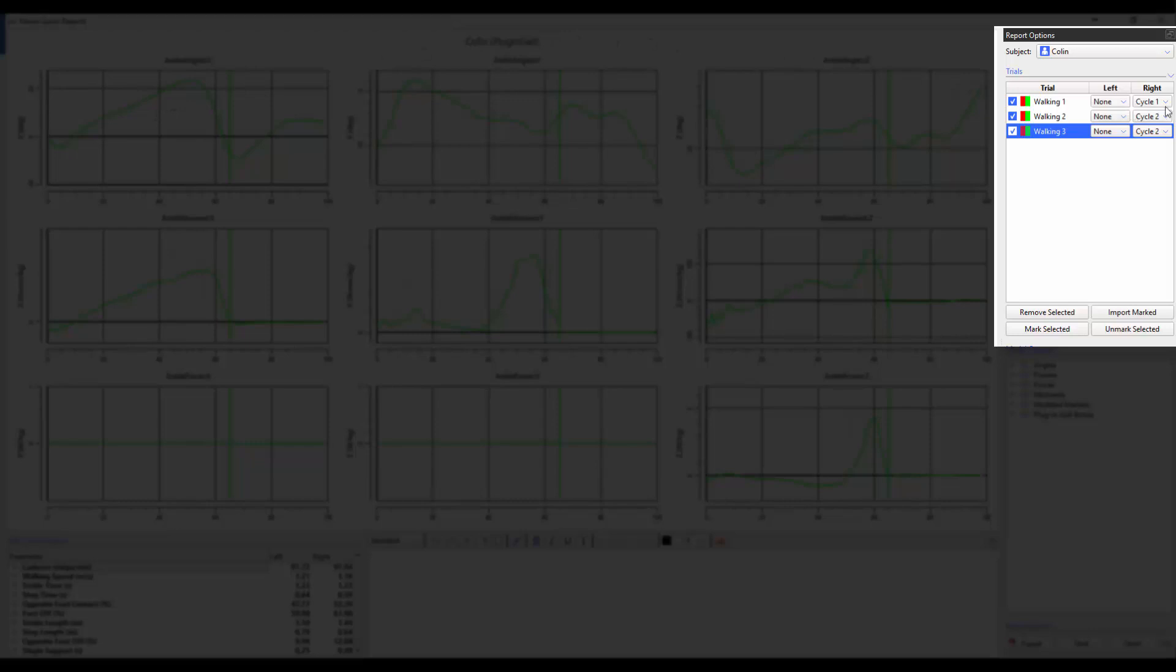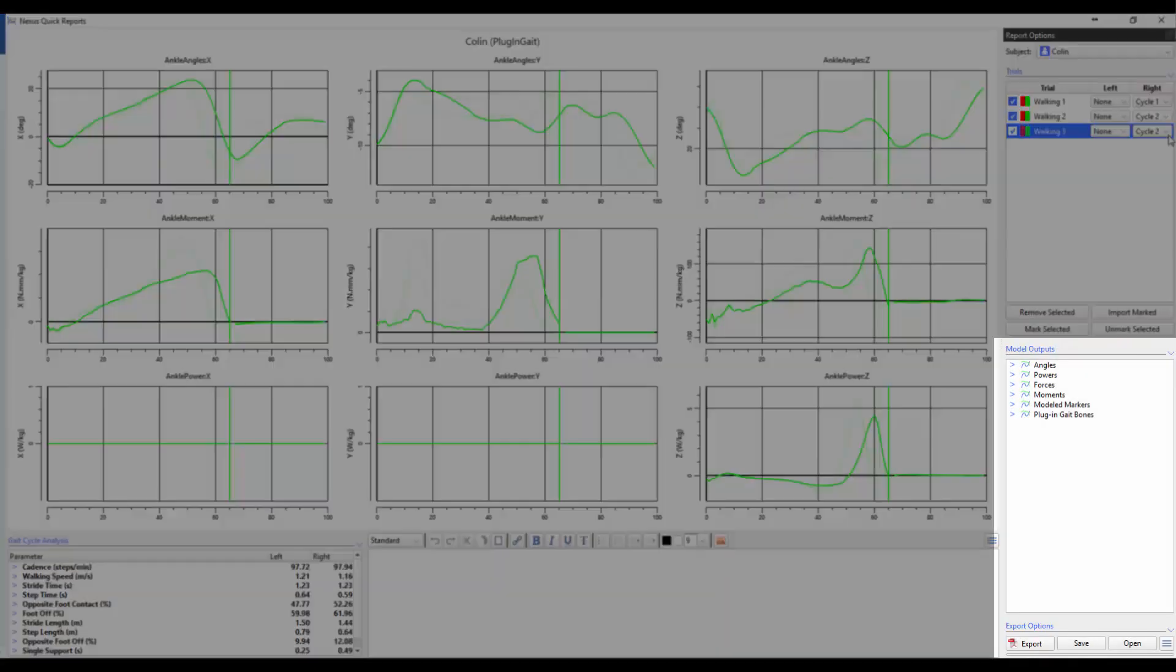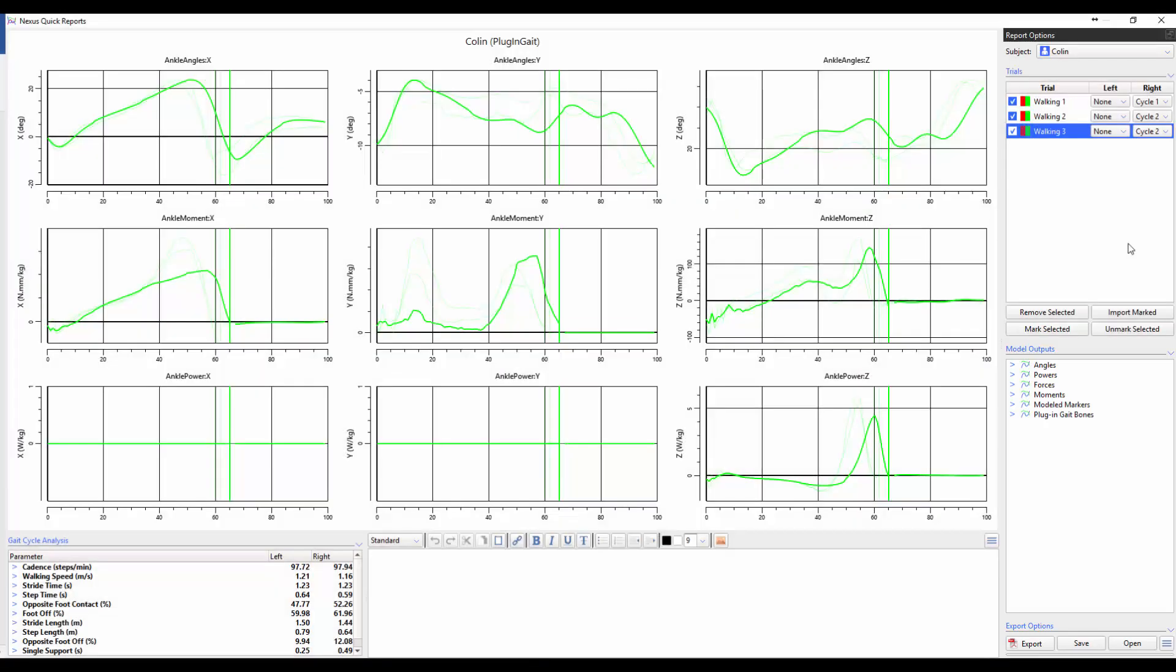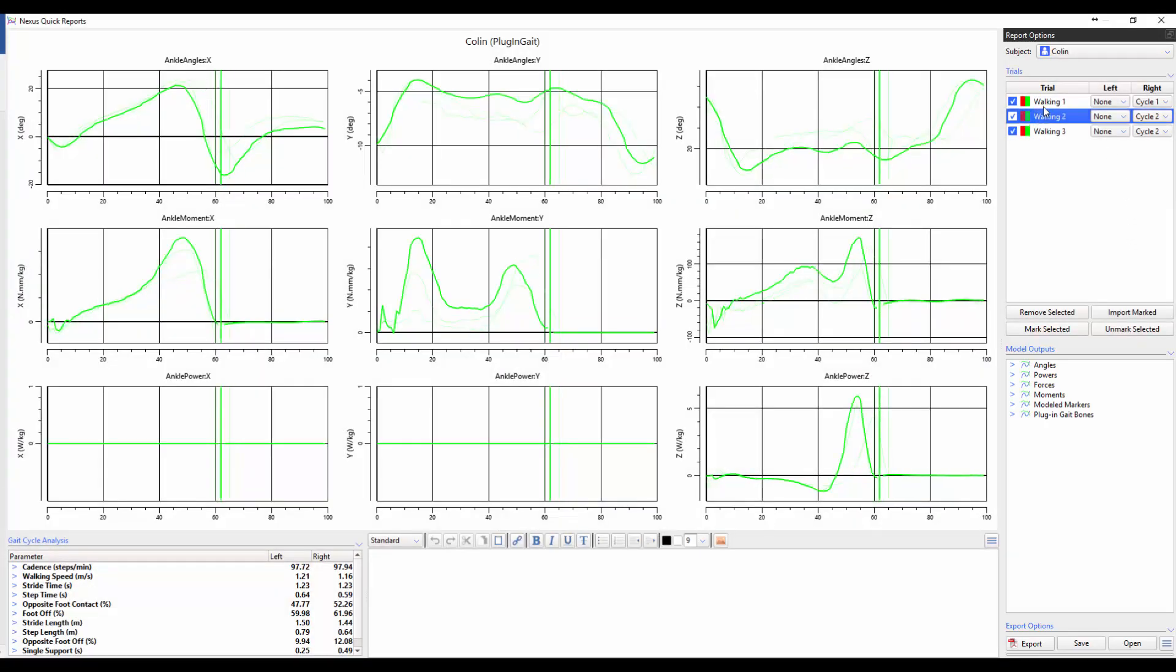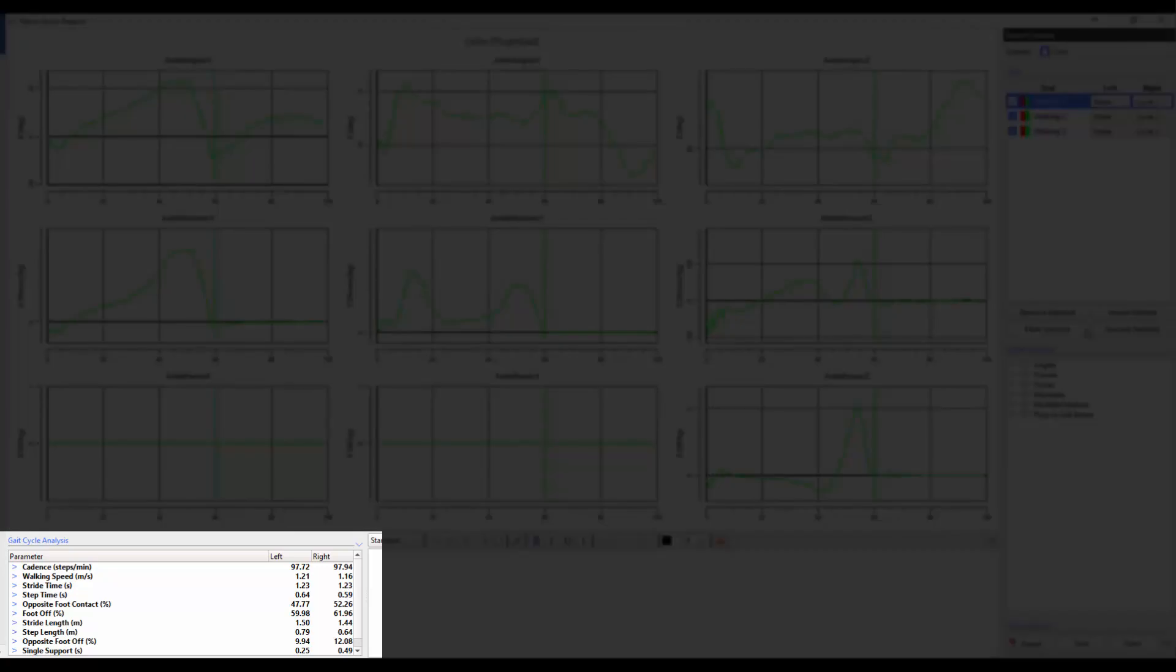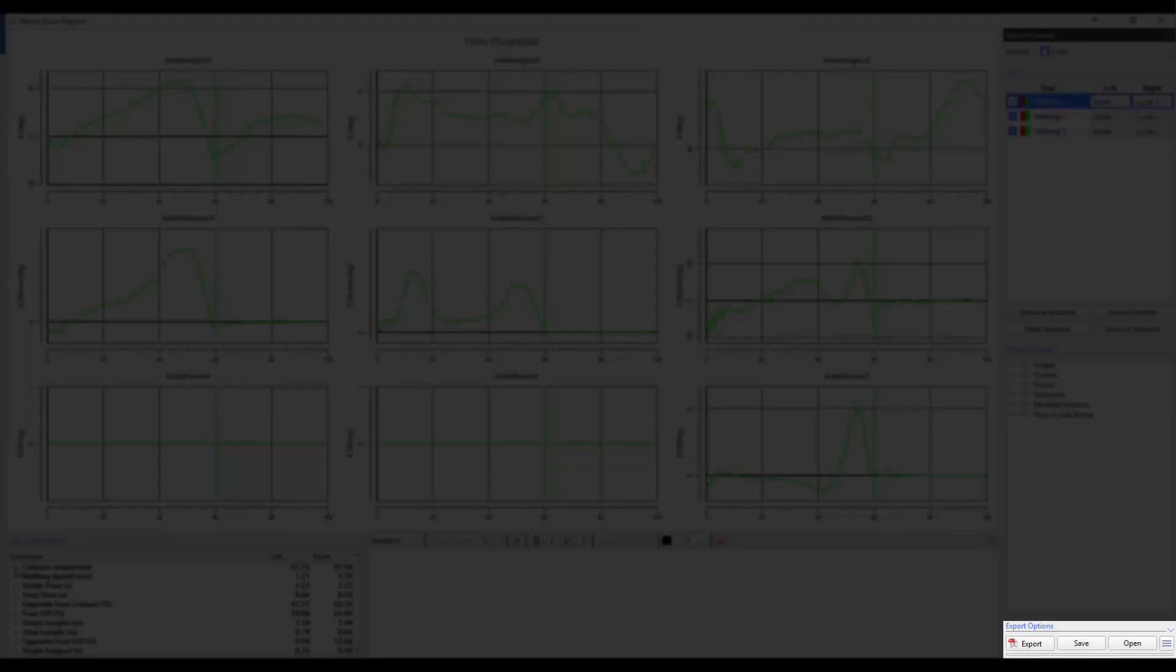In Quick Reports, you can select which gait cycle you want to view for each specific trial. You can choose the model outputs that you want to plot. You can choose to highlight the trial of interest. You can examine the average and individual spatial temporal parameters. You can write a report. And you can save the individual report, or the report as a template.